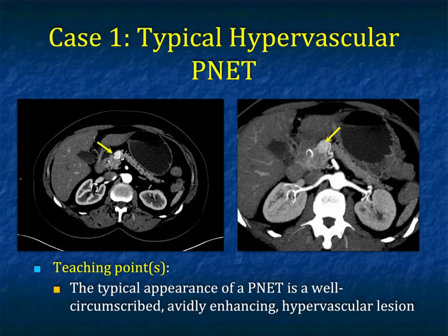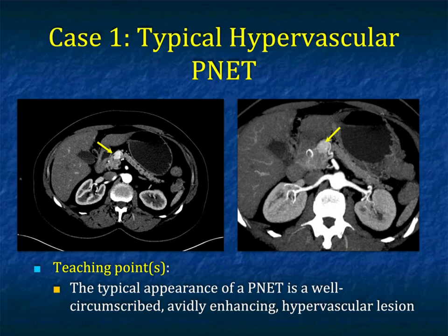I have more than a dozen cases that illustrate what we're looking at. This first case is the most typical hypervascular neuroendocrine tumor — a really nice example. The lesions are well-defined, well-circumscribed, and avidly enhancing and hypervascular. If this weren't a neuroendocrine tumor, I would be thinking about renal cell carcinoma, but the kidneys look fine. This is a very classic neuroendocrine tumor.